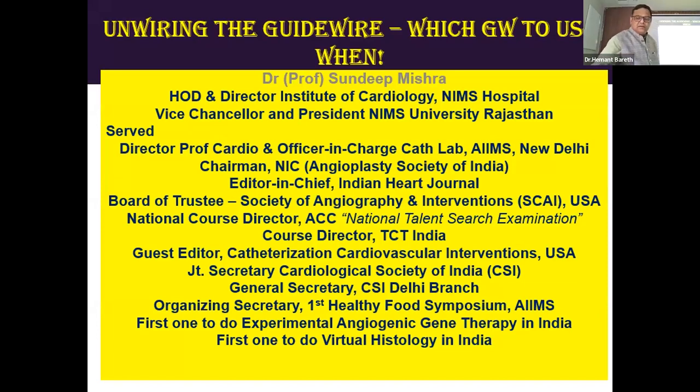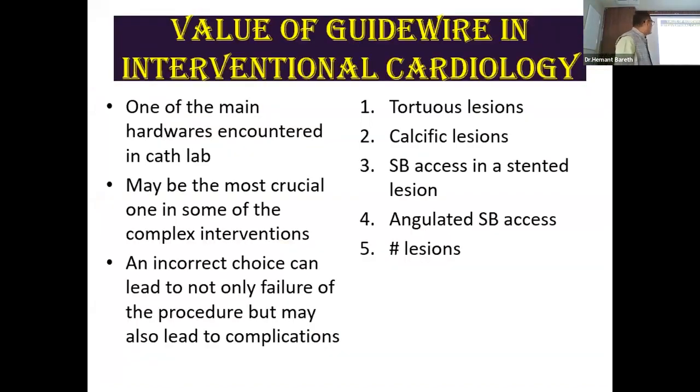I think we'll start. So today we are going to discuss unwrapping the guide wire, which guide wire to use when. So what is the value of guide wire in interventional cardiology? In many complex cases, it is one of the main hardwares required for successful completion of some cases. And an incorrect choice can not only lead to failure, but also lead to many complications.